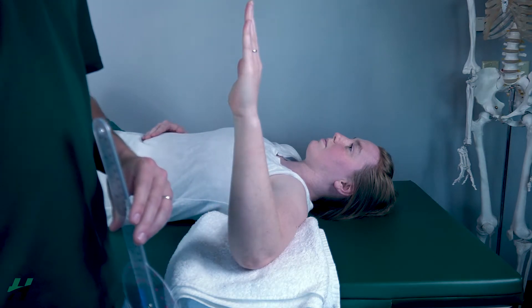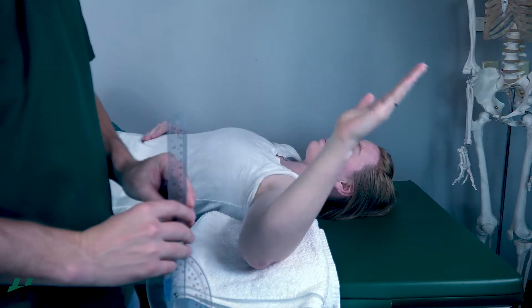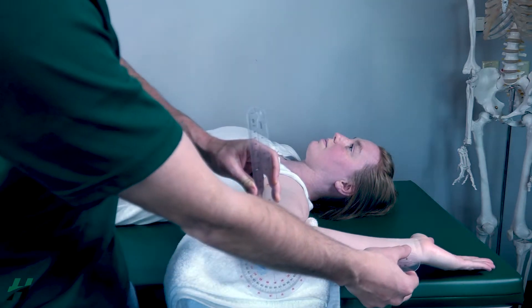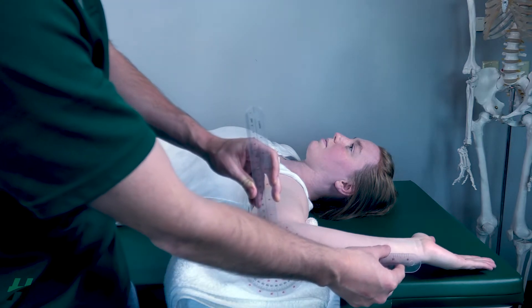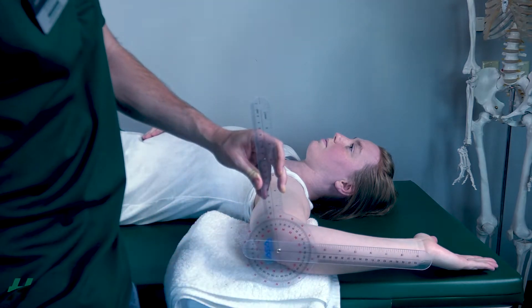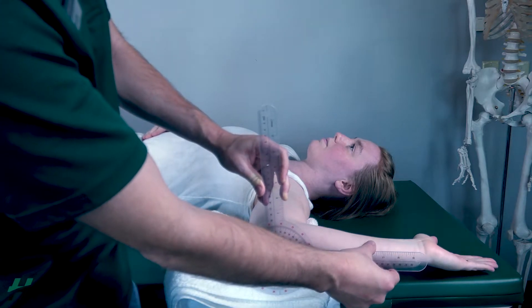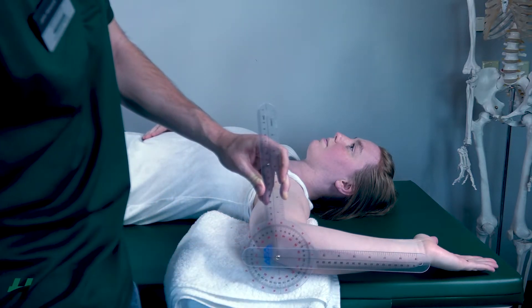Rachel, if you could perform full external rotation for me. Let me make sure that's lined up on the styloid, perpendicular — it'll look something like that. And for this, we're looking at 95 degrees of external rotation.